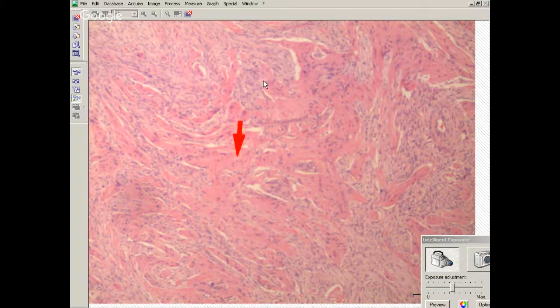So it's still a high-grade glioma. It's still a primary GBM. It's grade 4. It has a horrible prognosis, but the one thing to realize is that despite the fact that it's a biphasic tumor, it's only one population of tumor cells. If you do molecular analysis of these tumor cells, both biphasic populations have the same mutation. So even though it's biphasic histologically, it's a clonal population, and it still behaves like a normal GBM. So it still has a bad prognosis, okay?